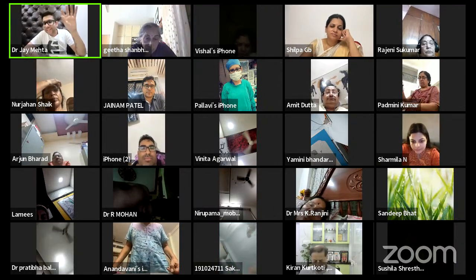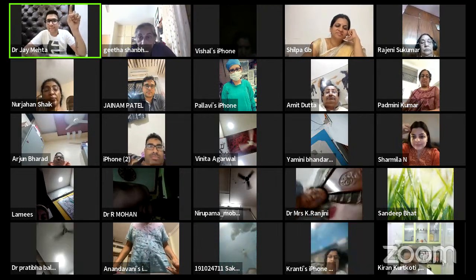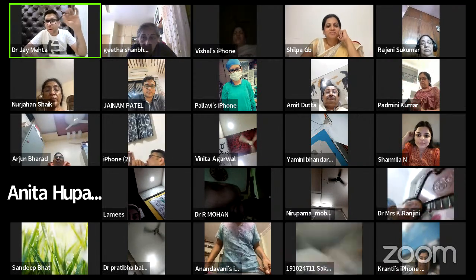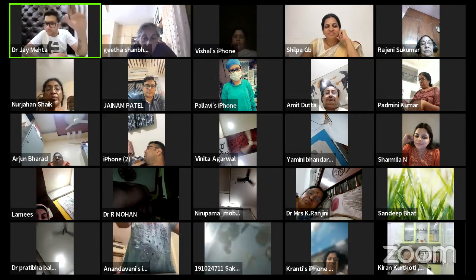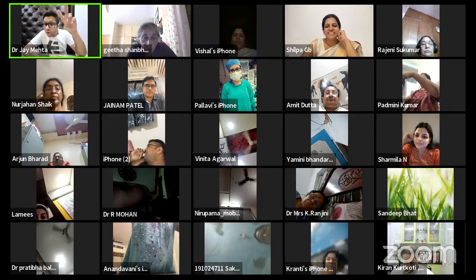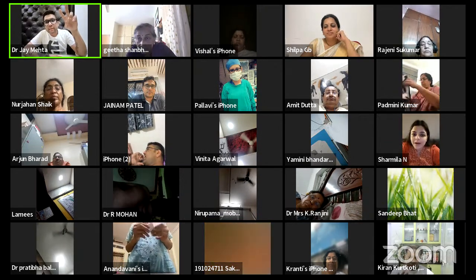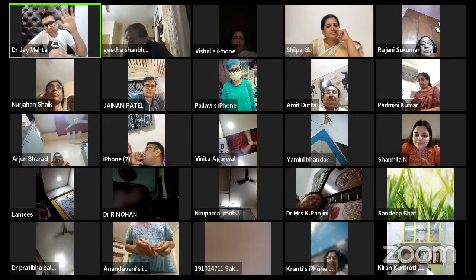You will have countless examples where it has perforated the other side of the tube, because you are trying to occlude it through the narrowest part of the cornua. And it will perforate very beautifully. We have removed 2 occluders from the sigmoid mesentery like this. Nothing happens. So that is why we don't want to do any such gimmicks.